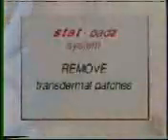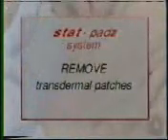Any transdermal patches in the way of the pads should be removed from the patient and the area wiped clean. Transdermal patches contain small amounts of metal and can cause burns during a shock. Often these patches are skin-colored, so they can be difficult to see.